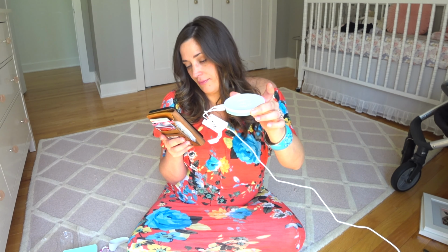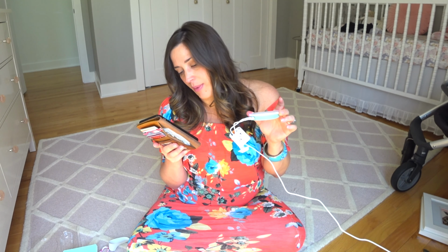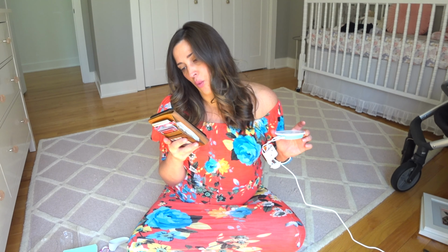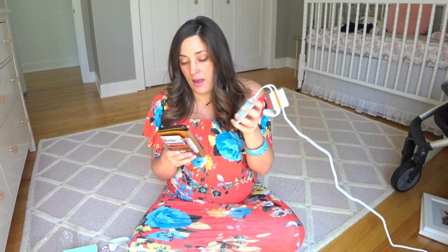Okay, solid white. If your base station starts to sound, simply press the top of the base station to turn it off, then press the next button and select Owlet Wi-Fi and wait to be brought back. Connection complete. So it says it's connecting, and then there's something on the bottom that says Wi-Fi and it's green, and then there's another area that says sock and that's also green.